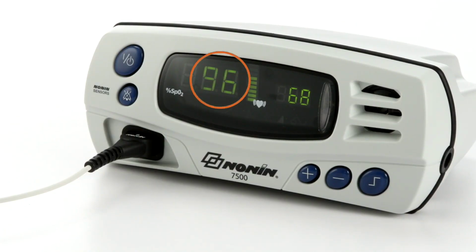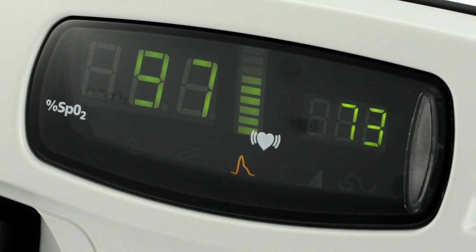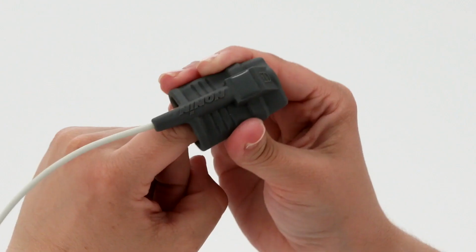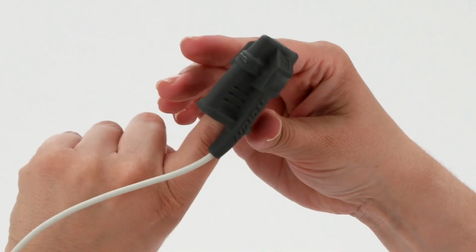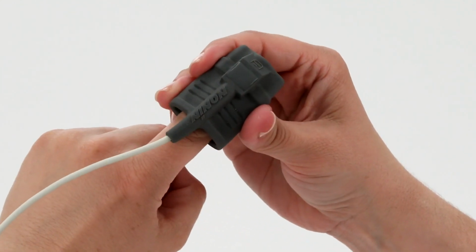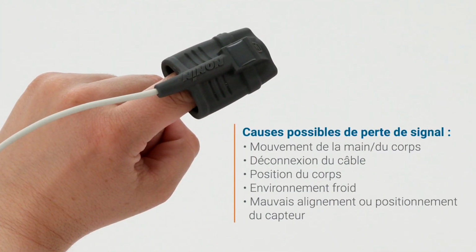The SpO2 level is shown on the left side and the pulse rate on the right side. The pulse strength signal bar in the center indicates the signal quality. Green bars indicate a strong pulse signal. Amber indicates a marginal pulse signal, and red indicates a low pulse signal. It's a good idea to check pulse signal quality at startup and adjust the sensor for a stronger reading if necessary. Signal loss from the sensor is possible with hand or body movement or disconnection of the cable.